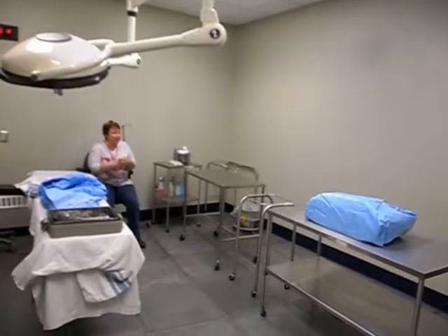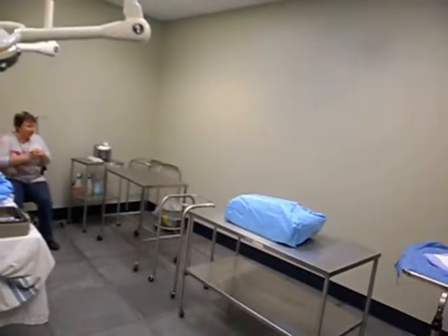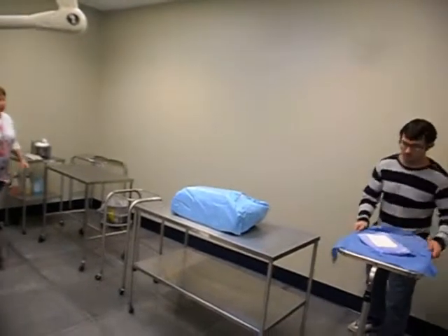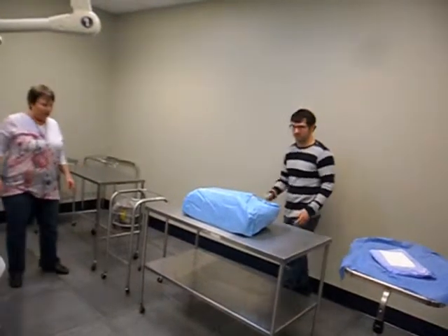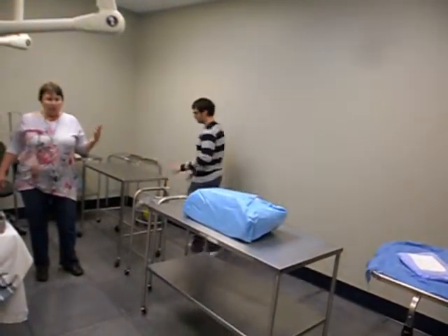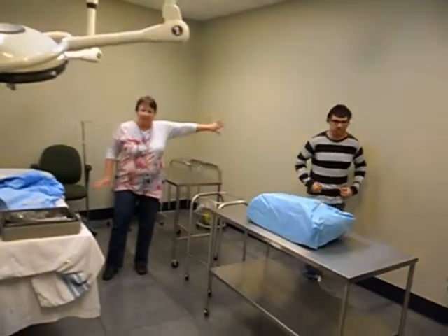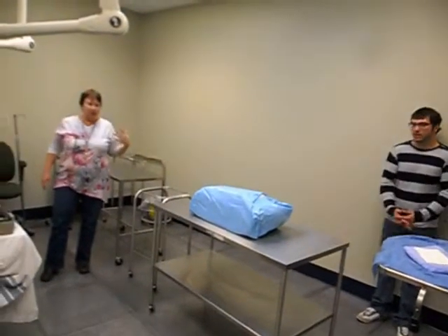So Joel, how many tables do you think you want? Big case, I'm gonna use all my tables, I think. Okay, right. And let's just do that for today anyway. It would be more common to put your Mayo stand actually between here, but you can leave it there. Now, in this scenario, we're taping this so you can see this. Truly, the room would be set up like this, but Joel would be facing the other way. And so just for purposes of filming, we're going to have him do it this way.